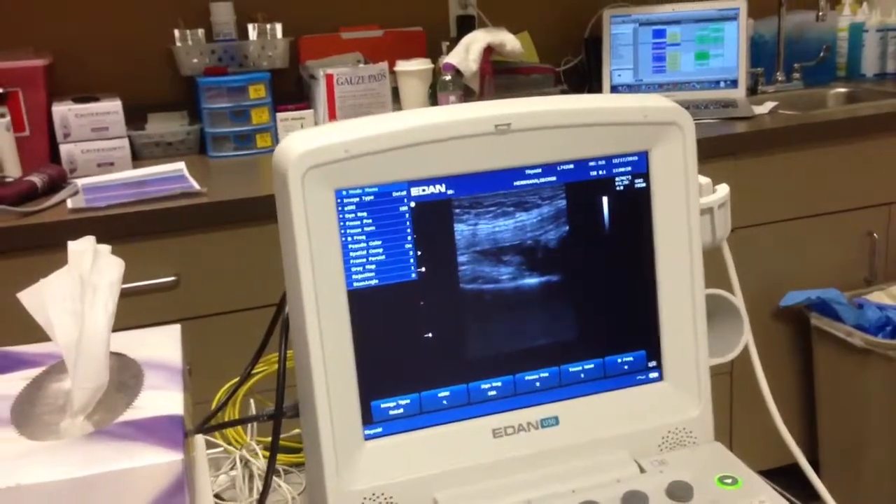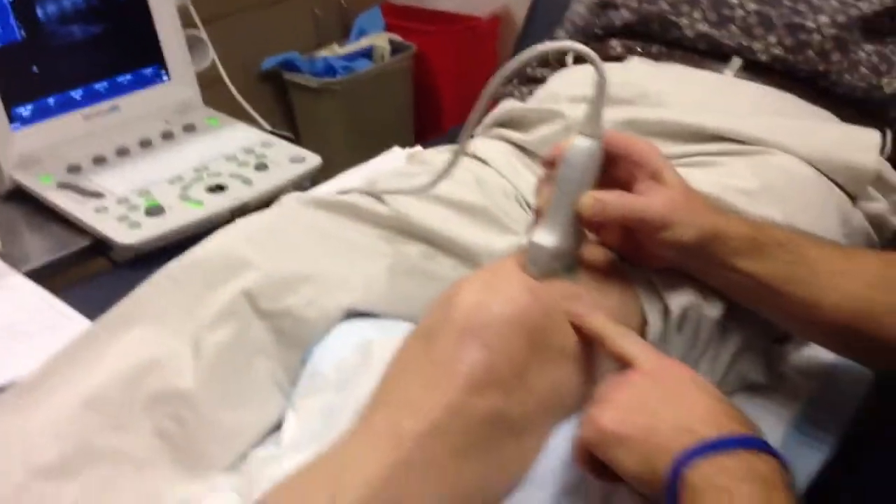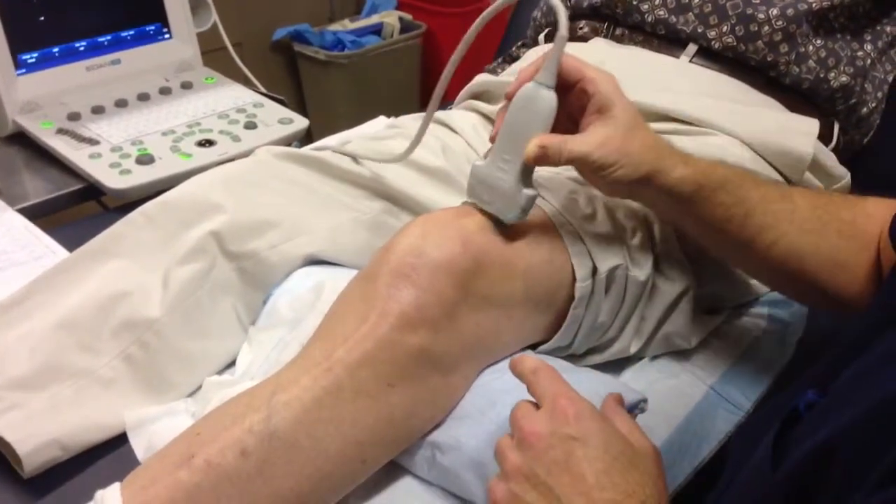Are you talking to me or to the video? No, I'm talking to the camera. And then just take a picture of this. So what I was actually doing was just kind of pushing like this, and that's in the long axis.